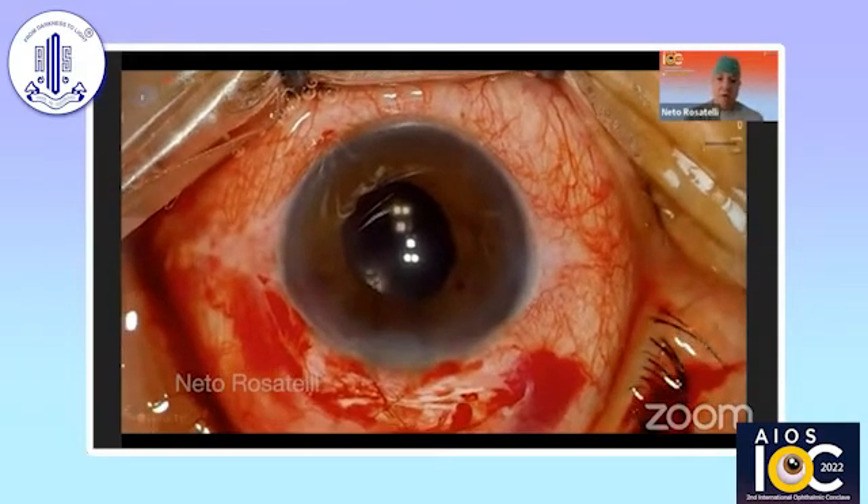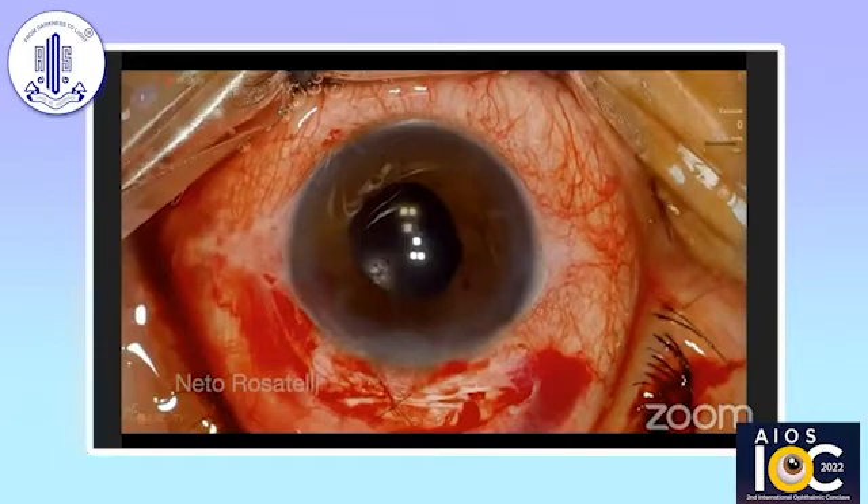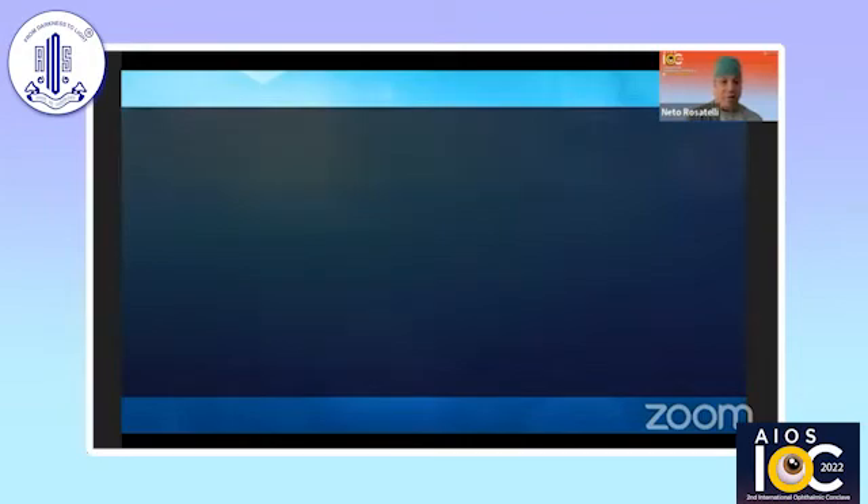We can see that the IOL is perfectly centered. It's a very satisfying technique to use in these cases. I'll now show some IOL anatomic relationships and the technique of suturing in this IOL fixation technique.